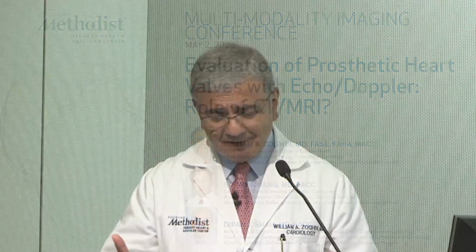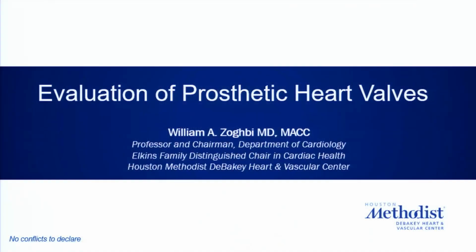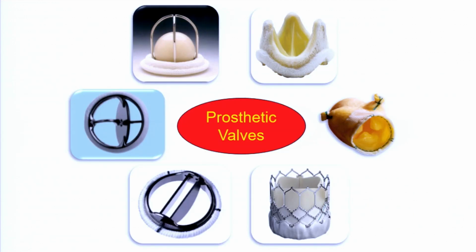I think even my two esteemed colleagues would agree that a first line of evaluation of these prosthetic valves, besides the clinical evaluation of whether this patient is symptomatic and what kind of valve they put in, is an echocardiographic evaluation, because it tells you about structure, but most importantly, function of these prosthetic valves. So let's delve into the topic.